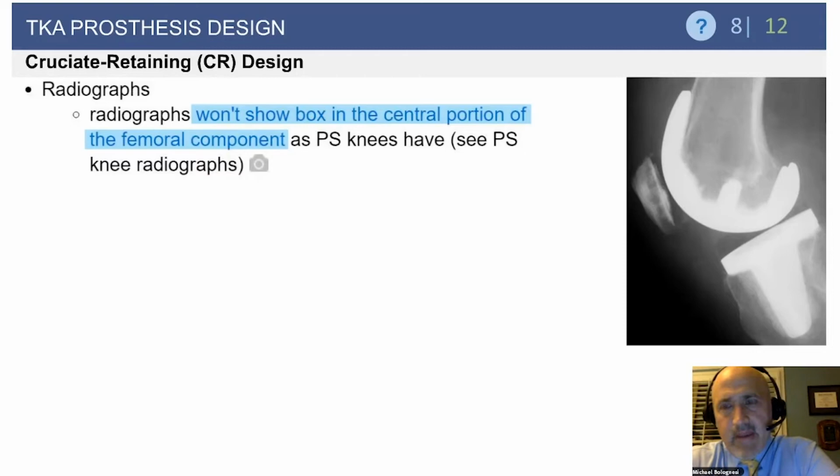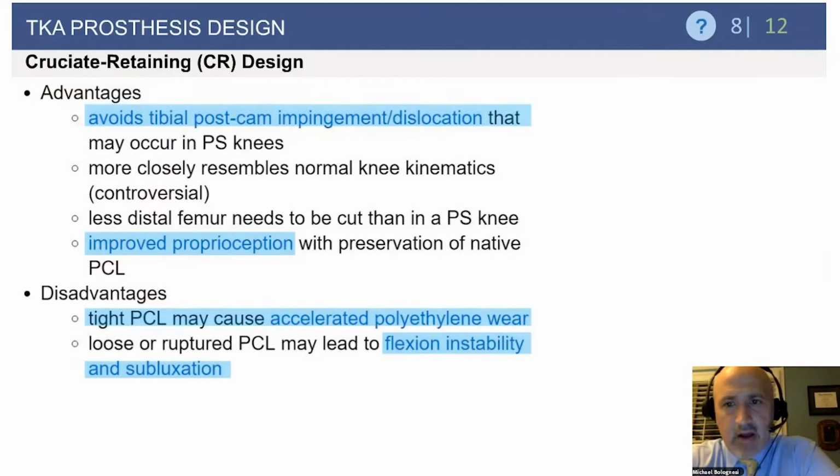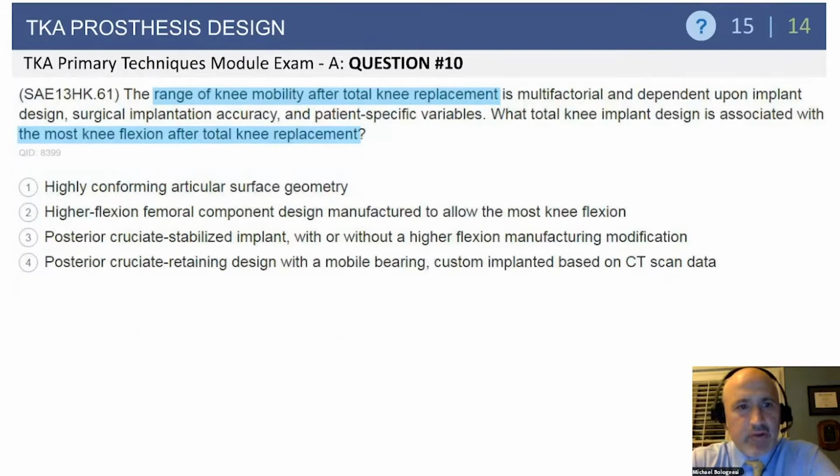I would point out that obviously you could use an ultra-congruent or anterior stabilized type polyethylene liner. We don't have anything on the slides on that, but you might want to understand that a CR femur could mate with that type of liner with the cruciate being out. The advantages of a CR design: you're not going to have cam-post impingement and that risk of dislocation, or impingement and poly wear that can occur with that design. Whether you get more normal kinematics is debated, but with the PCL intact, it has been purported that there's improved proprioception. Disadvantages: if it's too tight, that can cause issues with polyethylene wear, and if it ruptures late, that may set you up for a situation where the patient needs reoperation.